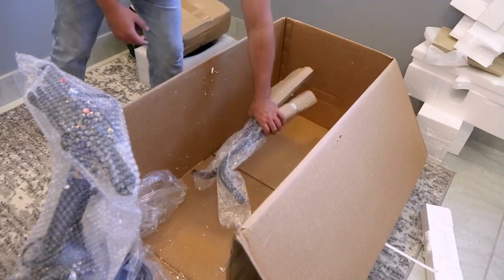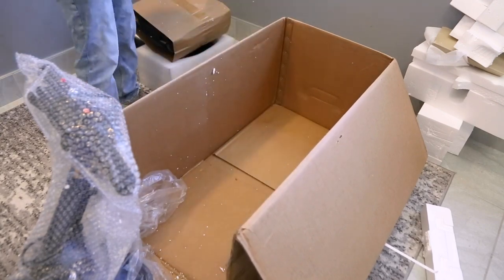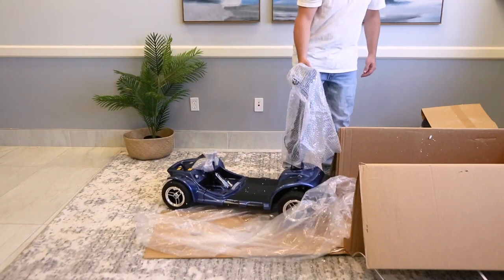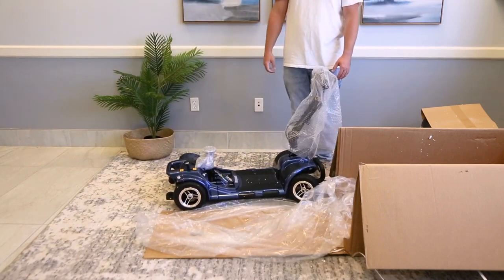See the armrest to the seat at the bottom? Grab those and set them aside to assemble later. Use the back handle of the scooter to help move the product out of the packaging. Now you can get the box out of the way and start the assembly.